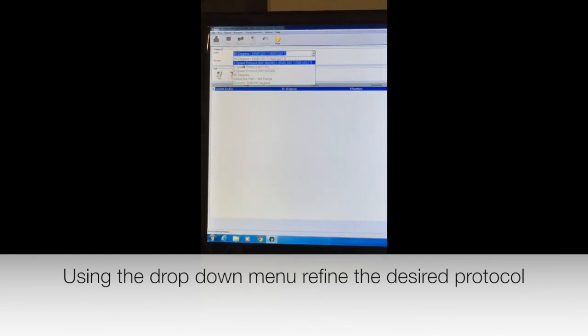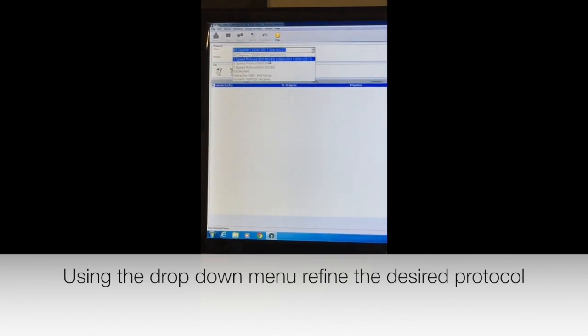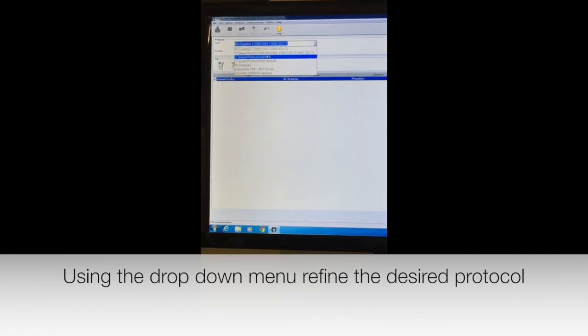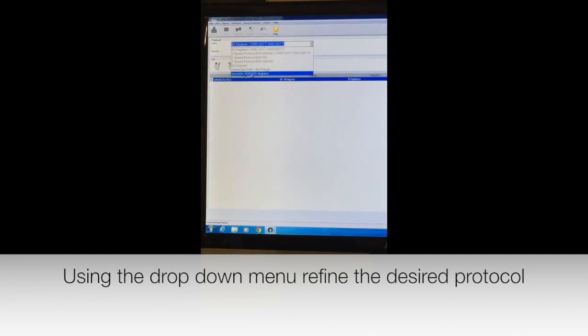Okay. A 3-speed protocol, which is 60, 180, 240 degrees per second. A 2-speed protocol, which is 60 or 180, so on and so forth, and they're all on there. Okay, 60 degrees. And then you've got isometric, which it does at 90, 60 and 30 degrees. So if you want to use isometric contractions, let me know and we can set it up.